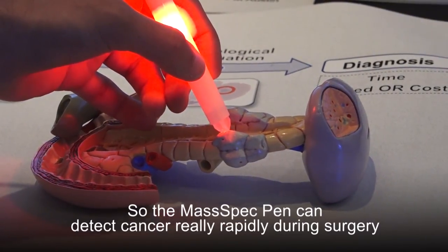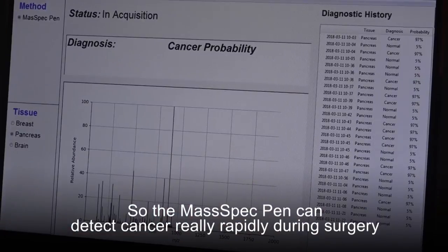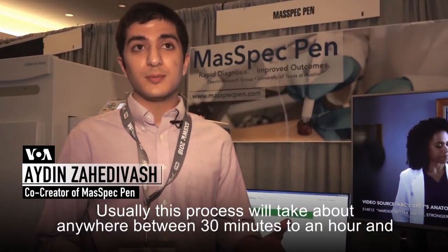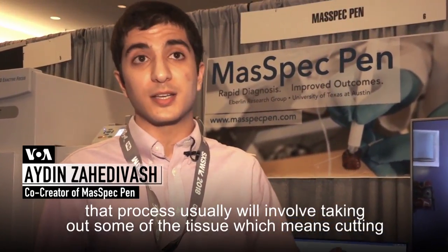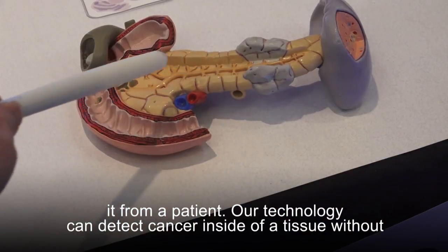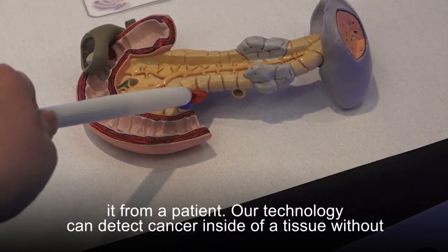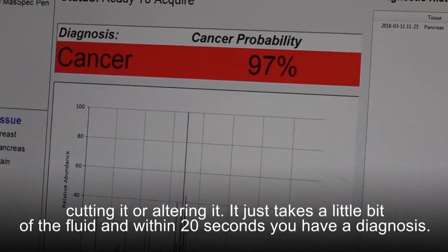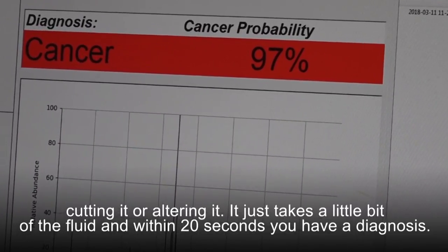The MassSpec pen can detect cancer really rapidly during surgery. Usually this process takes anywhere between 30 minutes to an hour and involves taking out some of the tissue, which means cutting it from a patient. Our technology can detect cancer inside of a tissue without cutting it or altering it. It just takes a little bit of the fluid and within 20 seconds you have a diagnosis.